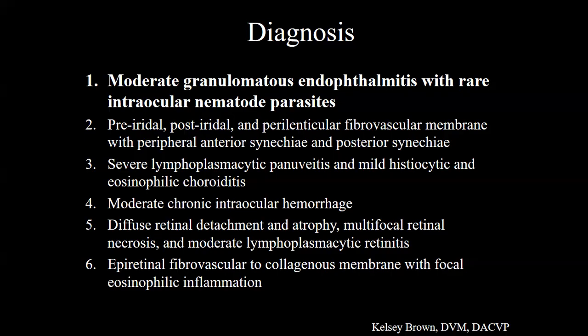Yeah. I had a similar case where you get a globe and you're like, why are all these eosinophils here and what is going on here? And then you're like, maybe I'll go deeper, and then you find something, you're like, oh my God, it's a worm. Yeah, so crazy. It's pretty cool.